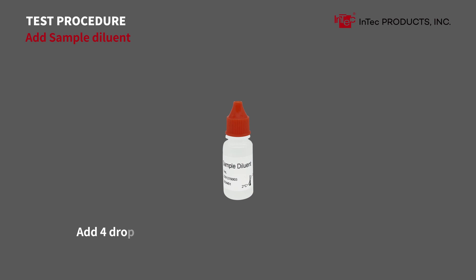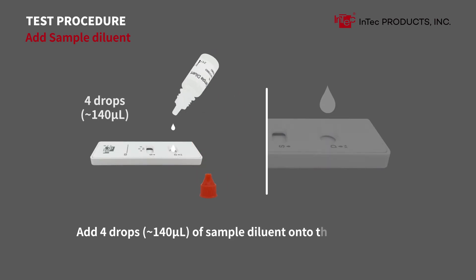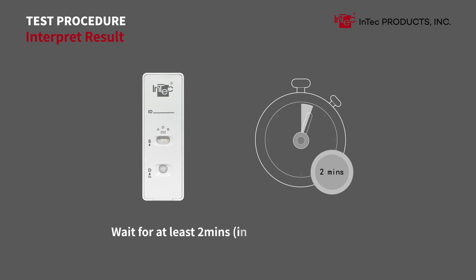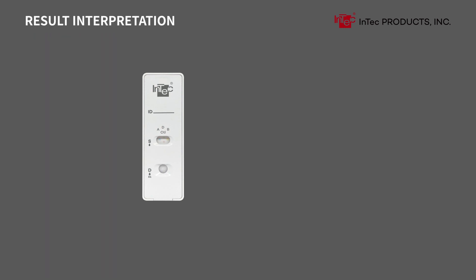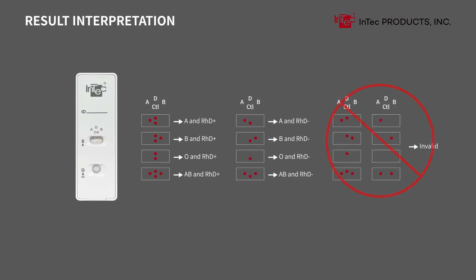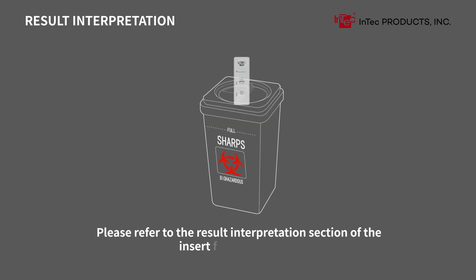Add sample diluent: add 4 drops or 140 microliters of sample diluent onto the diluent pad. Wait at least 2 minutes, then interpret and record the experimental result within 30 minutes. Please refer to the result interpretation section of the insert for more details.